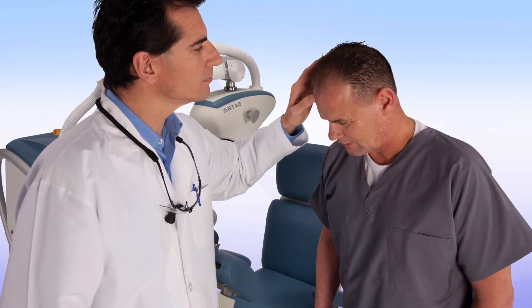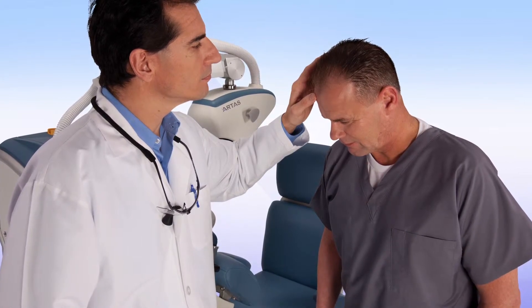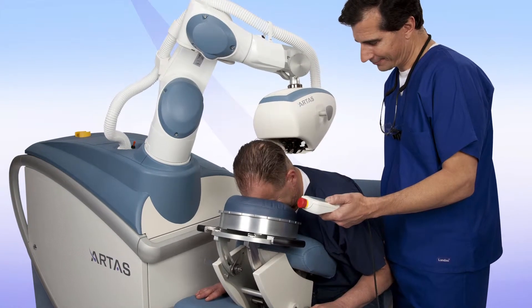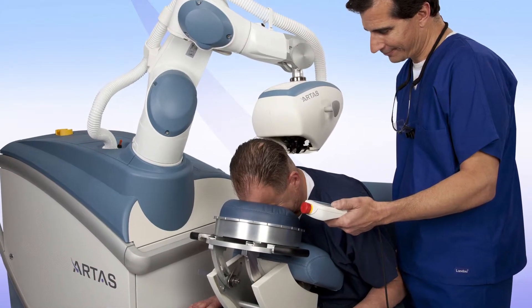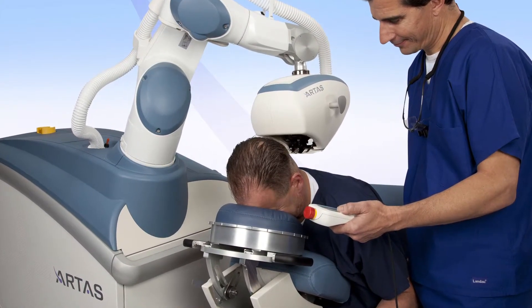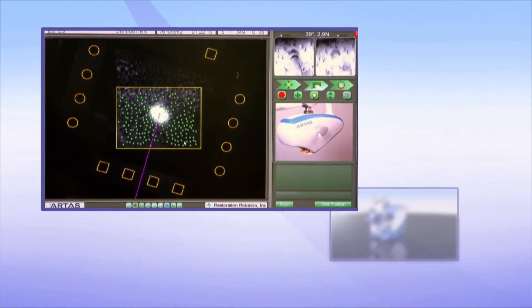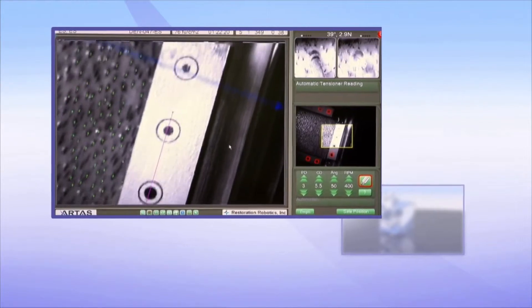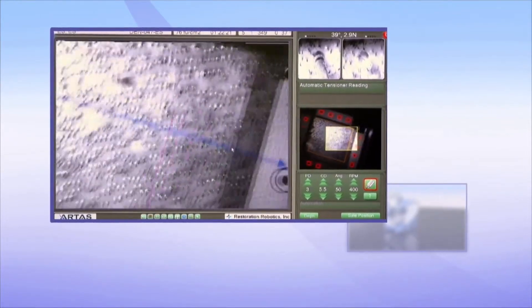Prior to the procedure, you and your doctor will discuss and determine the best treatment plan. You'll then be seated comfortably in the ARTAS chair, where your hair will be trimmed so the system can digitize each follicular unit. Your doctor will then position the robotic arm to start the procedure.